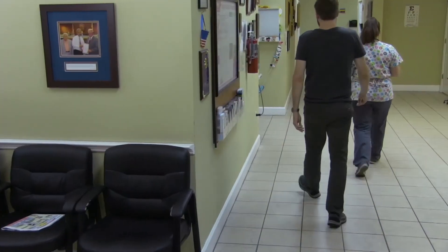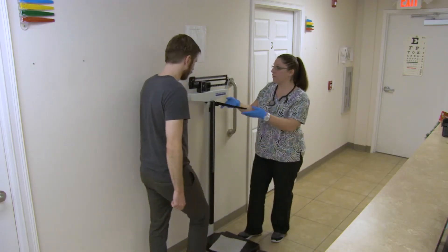Introduce yourself and explain the procedure to the patient, speaking at their level of understanding, while you confirm you have the correct patient. Assist the patient onto the scale and have them use the grab bars on either side, if available, to help them balance.